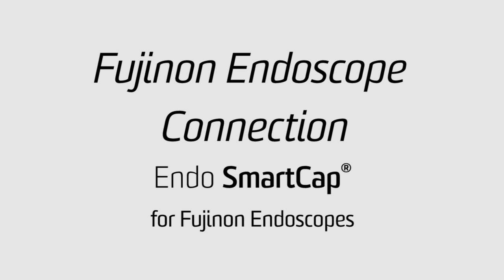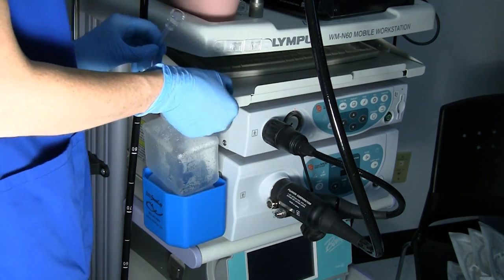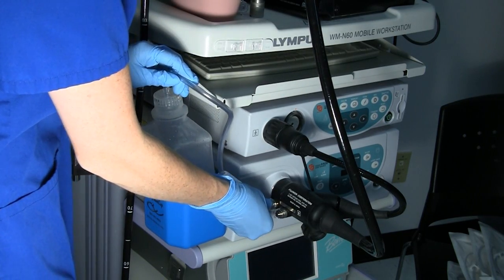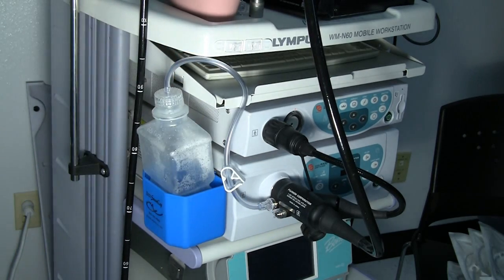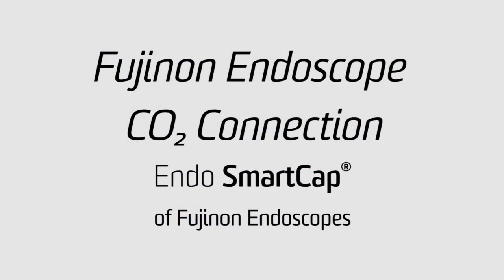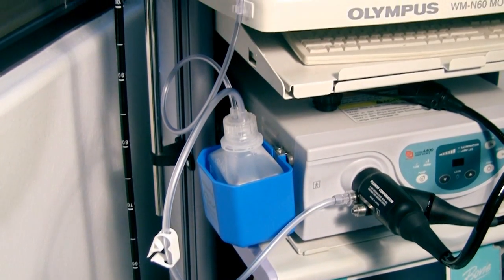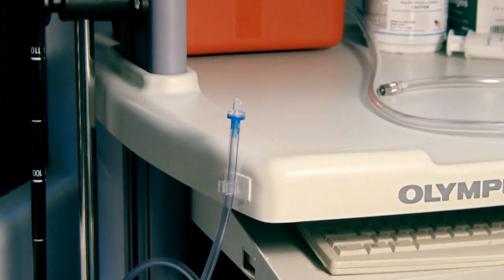With Fujinon scopes, the connector is a circular design that you push onto the scope, then turn clockwise, locking it into position, as seen here. For Fujinon scopes with CO2, connect the Fujinon Smart Cap to the scope the same as the normal air Smart Cap. Next, luer lock your CO2 tubing to the blue luer CO2 connector on the Smart Cap.